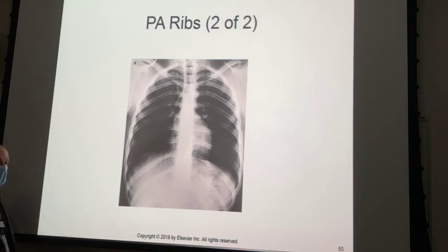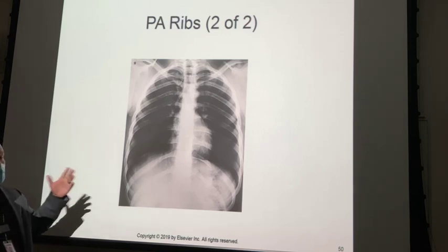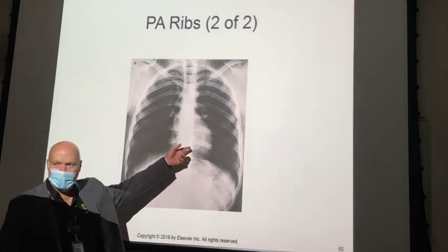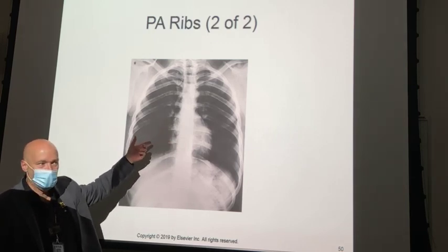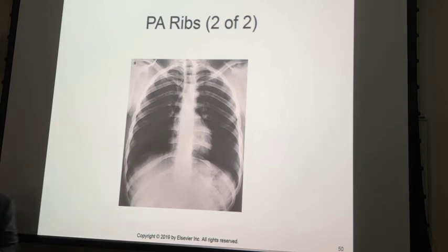And in imaging, Trina's probably gone over contrast and density, and it's kind of hard to tell the difference between contrast and density, because you have to have both. But what we've got here is high contrast because it's very black and white, with too much density, right? Because you can't see the ribs. So it's a delicate balance to get high contrast and adequate density. But overall, it's not a bad set of ribs. You can see the upper ribs very, very well.